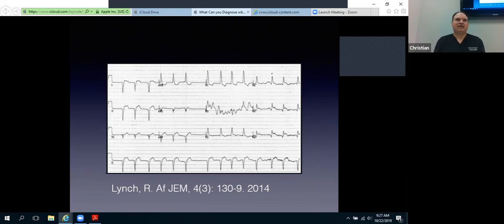And the reason that has to do with that is that there's what's called the Wilson common terminal, where basically the limb leads all create like a circle around the patient, and so that has more or less the same radius to the chest, because the same distance from the heart, more or less, and they cancel each other out, and they are the ground for the precordial leads.